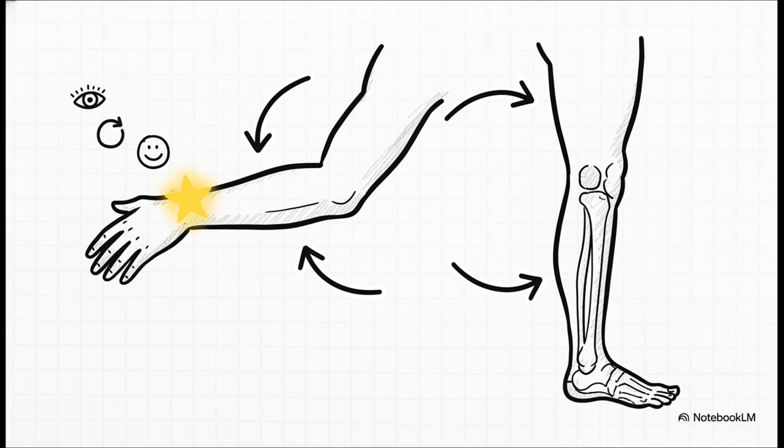So, where do we get the sample? The radial artery in the wrist is the go-to choice, hands down. Why? It's easy to get to, it has that great collateral circulation we just confirmed, and it's usually more comfortable for the patient. Of course, there are other sites, but for most cases, we stick with the radial.